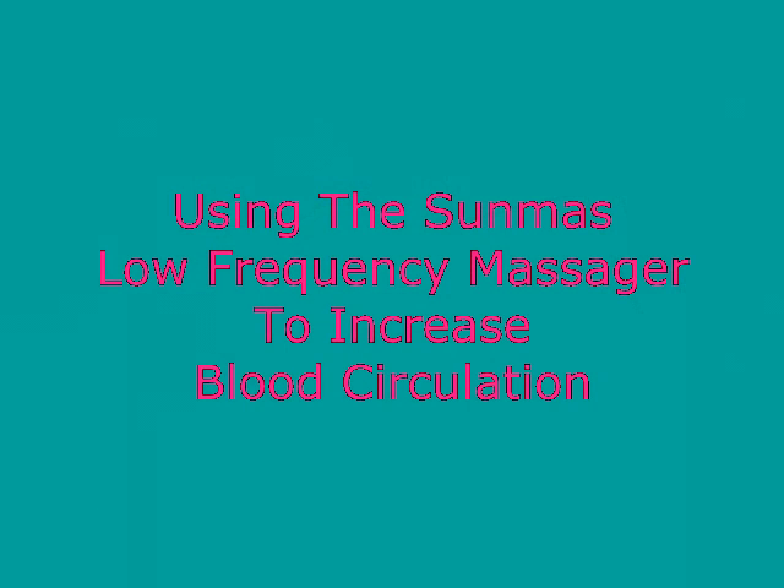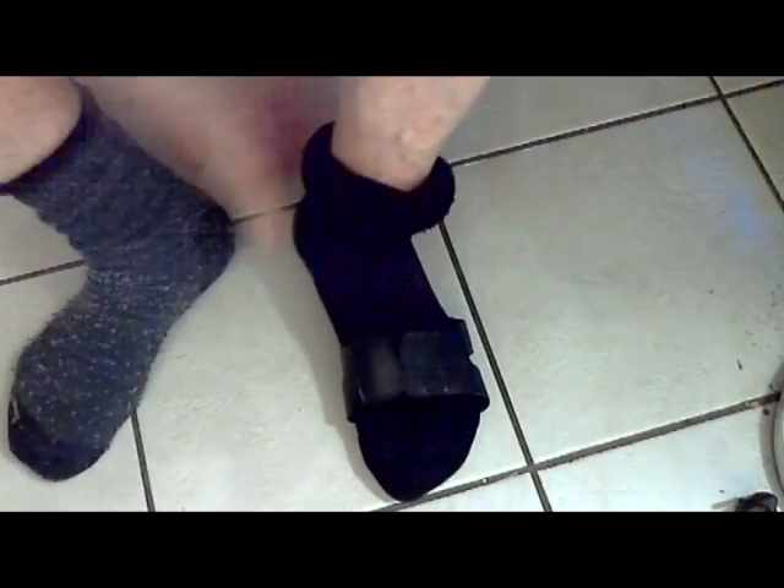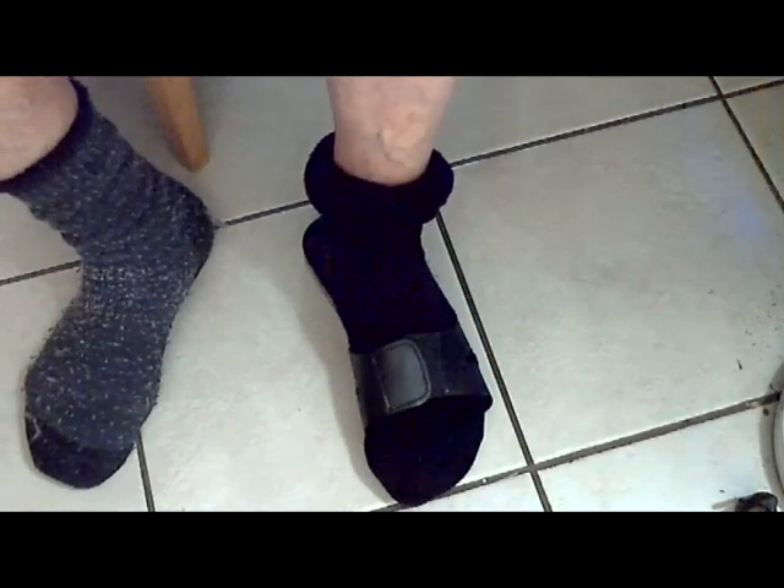Now I'd like to show you how you can increase blood circulation to a foot or any other area where there's been a muscle strain which could be helped by increased blood circulation. I'm using the foot as an example, as diabetic foot pain is widely suffered and is considerably relieved by improved circulation.